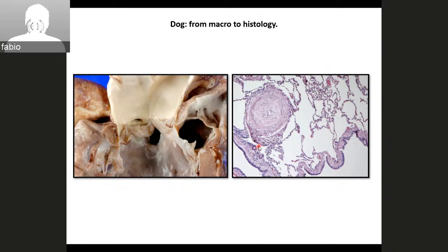These small tubular structures are the glandular component close to the bronchus. Everything is normal. But in general, what we see also in the lung, very important for function.